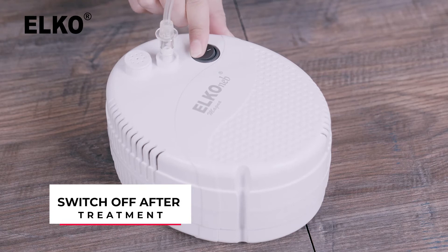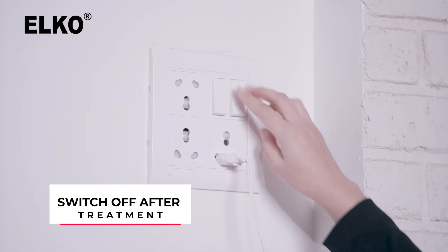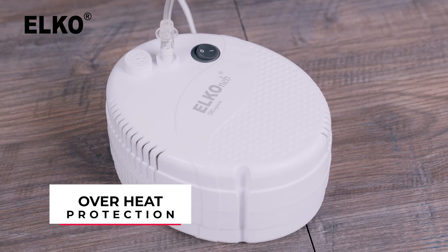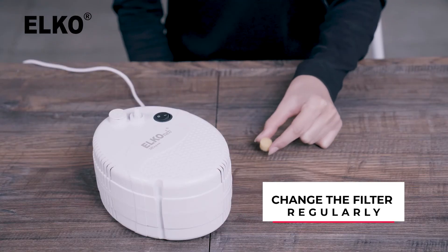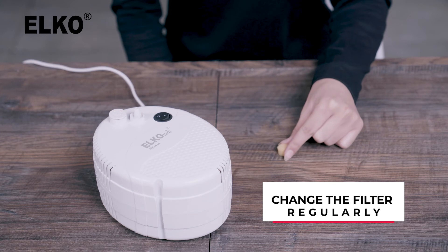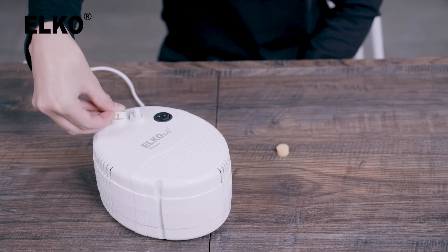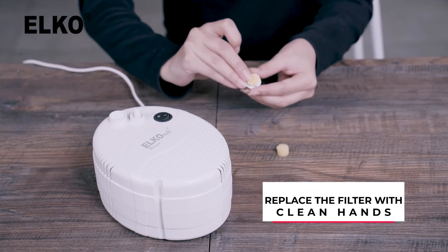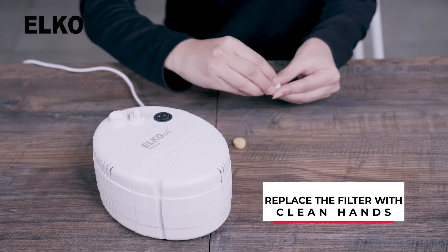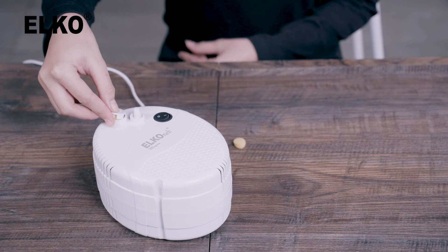Once you're done, switch off and unplug the power cord. To protect against overheating, the compressor motor has a thermal protector that will shut off automatically if heated. Make sure to change the filter every 30 days, or sooner if the filter turns gray. Never reuse the filter by washing it. To change filters, remove the old filter with clean hands and replace it with a new one. Always use the nebulizer with a filter.